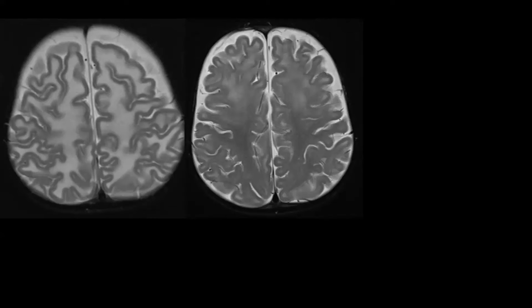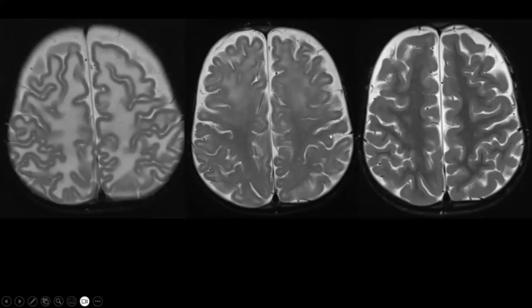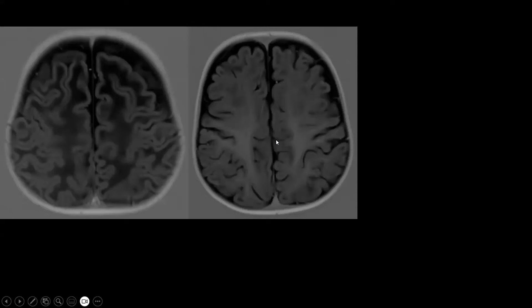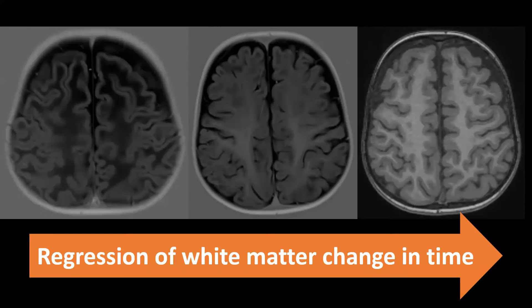The brain looks a bit swollen, which is also the reason the patient has a macrocephaly. On follow-up MRI studies performed at different time points, we can see regression of the white matter abnormalities. So you have regression of white matter changes over time. On T1 weighted images, the signal of the supratentorial white matter becomes normal over time, and in this patient the brain looks completely normally myelinated. This regression is possible because the pathological substrate is not a direct lack or loss of myelin.